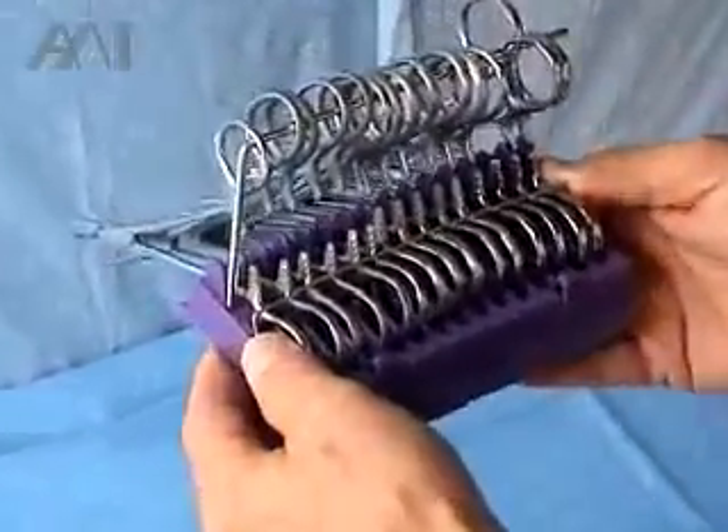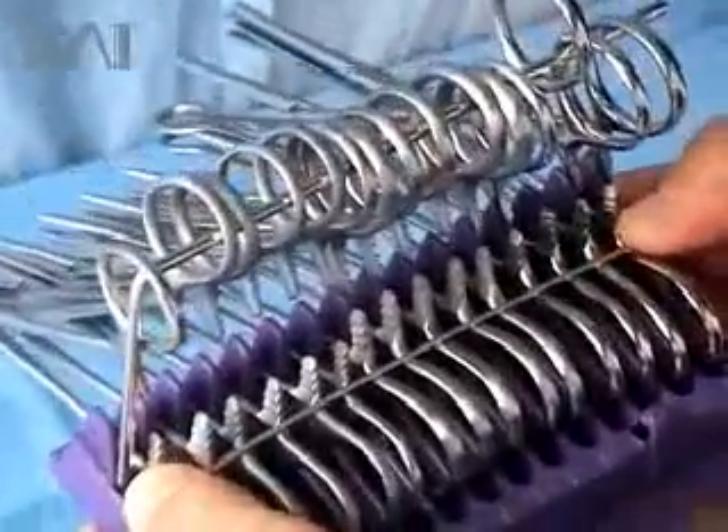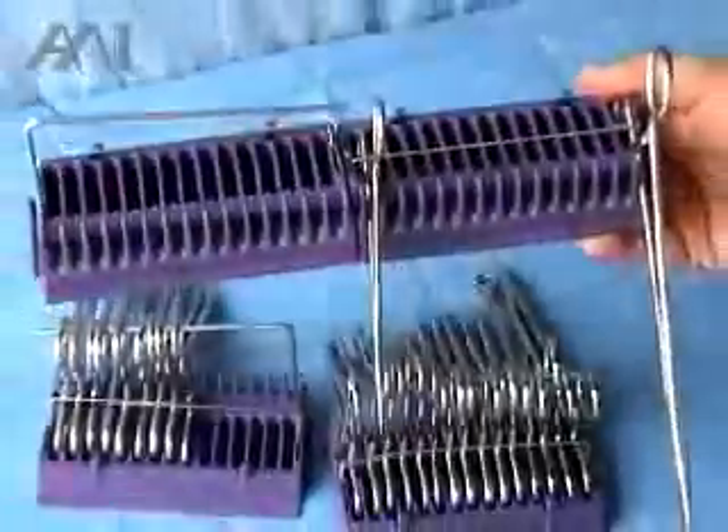Those trays can go into the sterilization trays where the instruments usually go. You can also pre-attach two units together for 30 instruments as well.